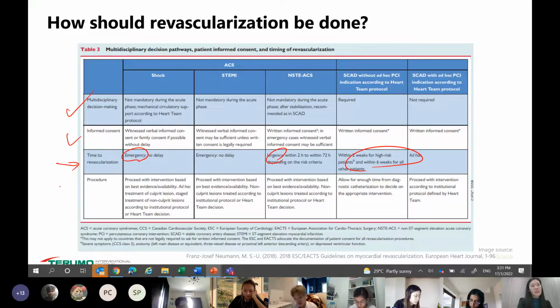For the last one, it just means that in your coronary arteries there are different branches, and not just one branch may be affected; maybe other branches are affected, but to different extents, different degrees, different impacts. So it doesn't mean that if I want to treat, I treat everything. That's because, as I mentioned, treatment has its risk. So they may not actually want to do that. They may just treat the most important ones and leave the rest as they are. So all these decisions have to be made, and you will hear discussions of this in the cath lab.